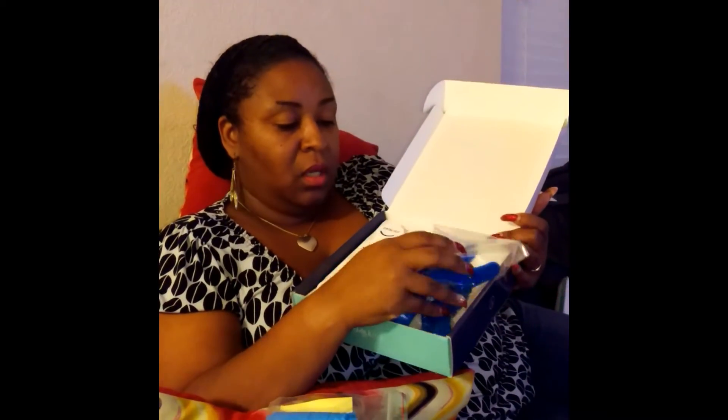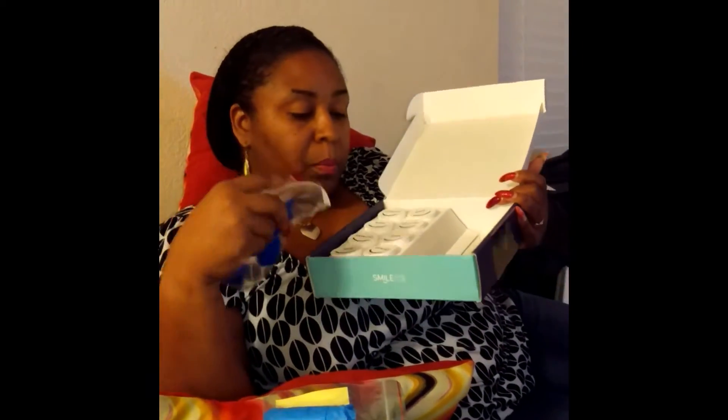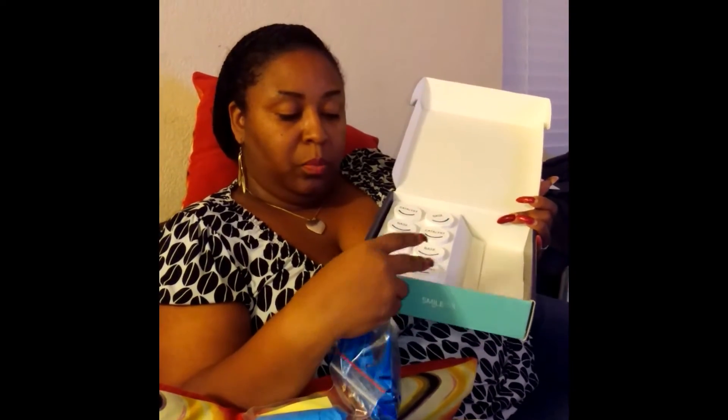It gives you a pair of latex gloves, and then here are your trays. What you pretty much do is you bring these two clays — it's like a clay — and you roll it for about 20 to 30 seconds, mixing it completely. Then you put the clay inside the tray. You put it in your mouth, bite down on it, and follow the instructions. Once you have four — two for the top and two for the bottom — you put them back in the bag, seal it up, and it already has a package ready to be shipped back out.